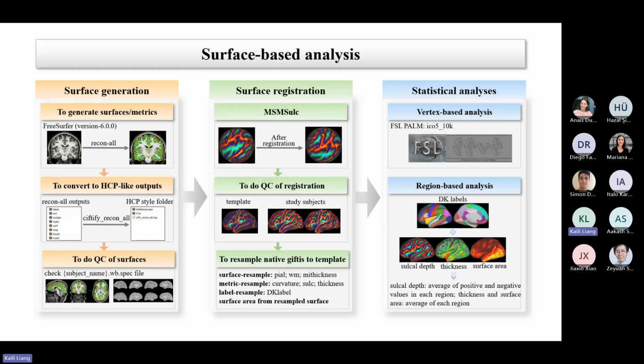If your main source of errors is the segmentation, then replace it. FreeSurfer segmentation, as far as I was aware from the original papers, basically looks like intensity-based thresholding with a few corrections. Nothing that sophisticated.